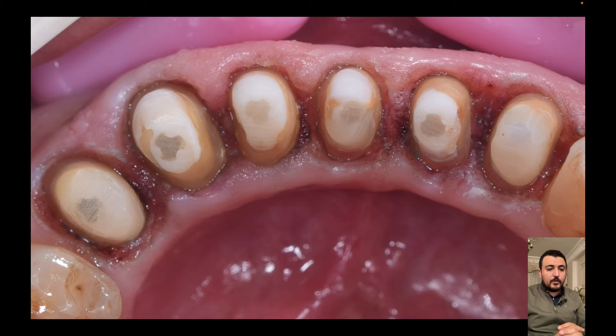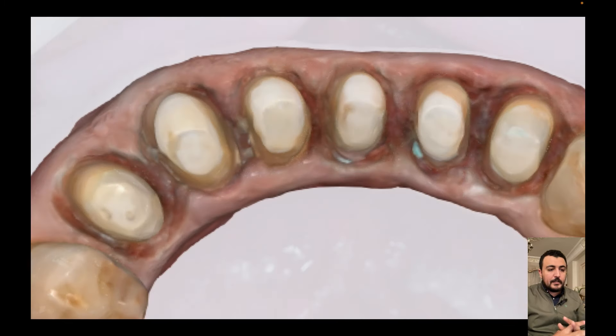Here is after removal of the cord and the paste. And this is the final scan with completely retracted soft tissue.